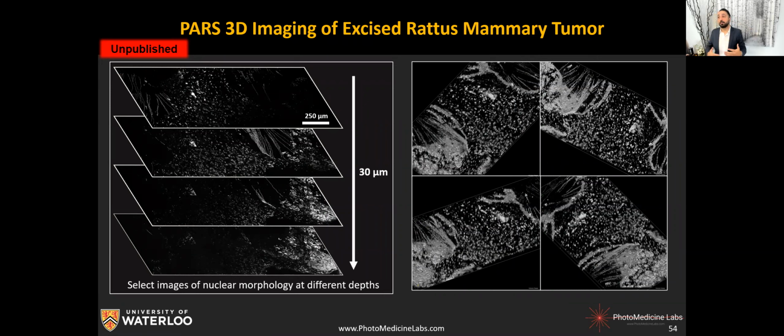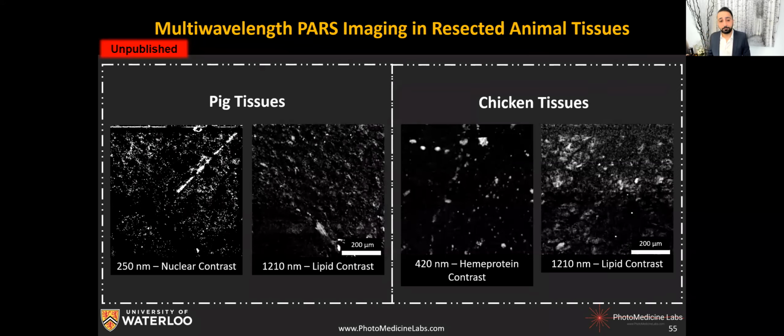And all these things really can add up for the future, hopefully toward the ultimate goal we have: to either have a device beside the surgeon, so immediately after the surgery they put this resected tissue in, get all the information they need to finalize the cut, making sure everything is removed, or even one step above that, to have a surgical microscope that in situ we can actually directly see, cut, and remove the entire area.